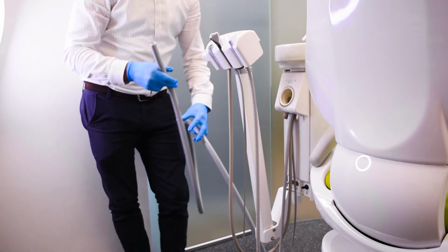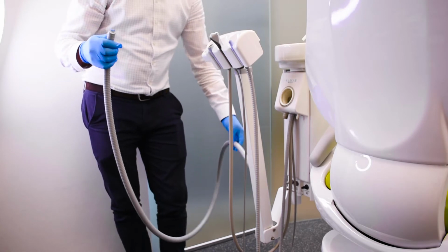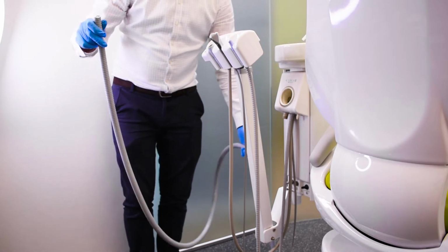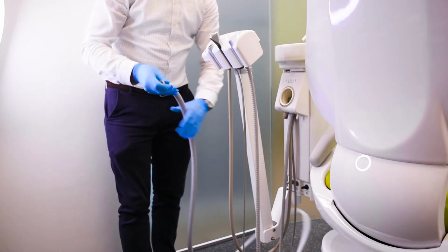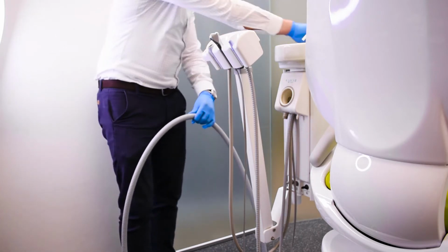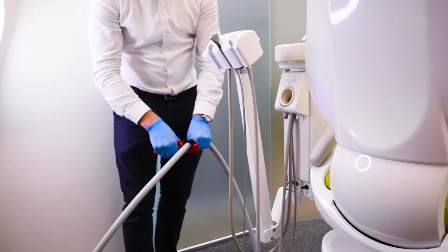So in terms of cutting the new suction hose, it's down to your preference as to how long you cut it. They come about 1.6 metres usually, but you can cut it shorter if you want to save on hose use. 1.2 is probably a sensible length, so I'd measure out 1 metre, 200mm, and then with some scissors, or in this case I've got some cutters, but scissors will also do it. Very simply just apply them and cut the hose, like so.